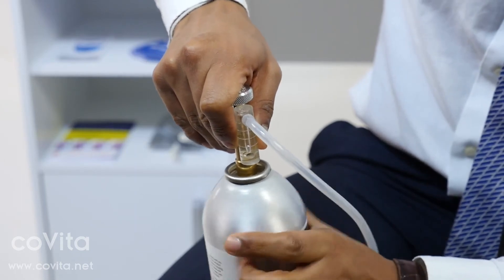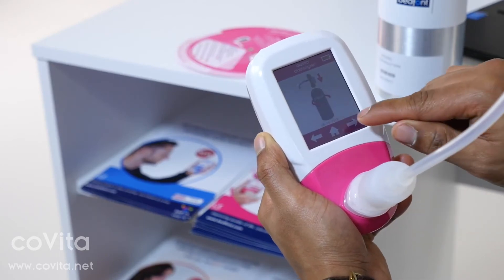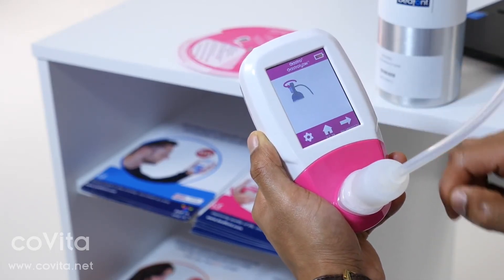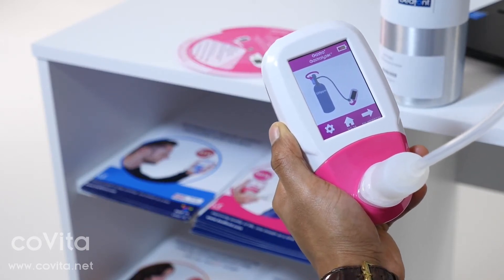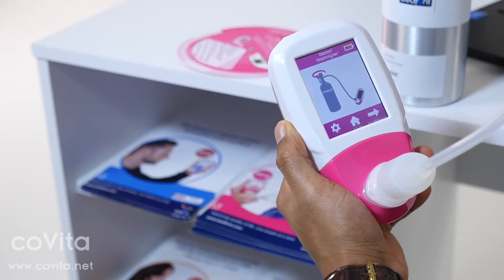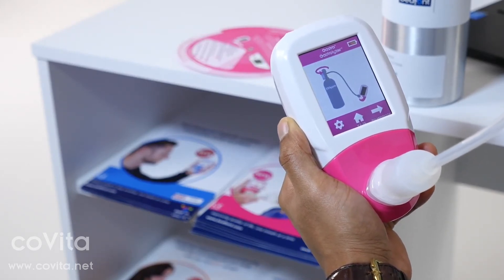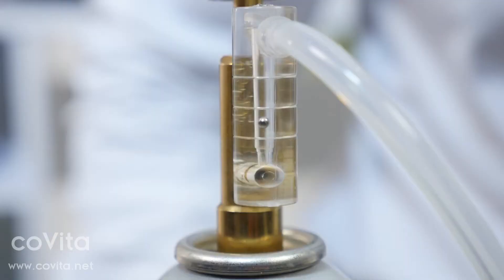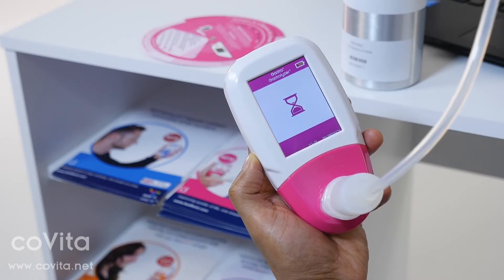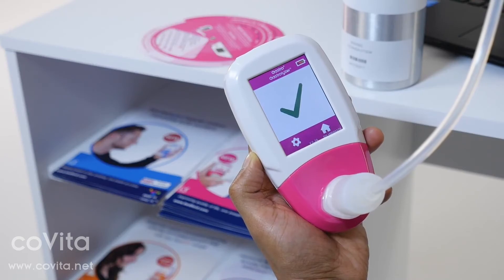The Gastro Plus will zero automatically while the egg timer is shown. When zeroing has finished, the first step of the calibration process will be shown on screen. Follow the on-screen instructions to finish the calibration process. Gas flow should be set to 0.5 liters per minute. If calibration has been successful, a green tick will appear on screen and you can return to the home screen.